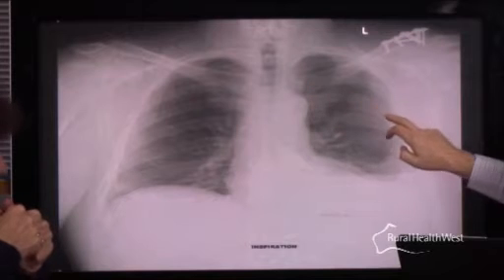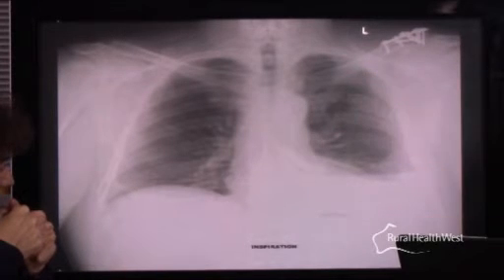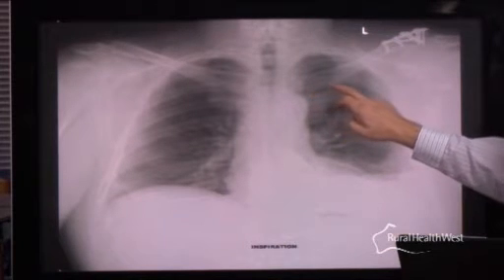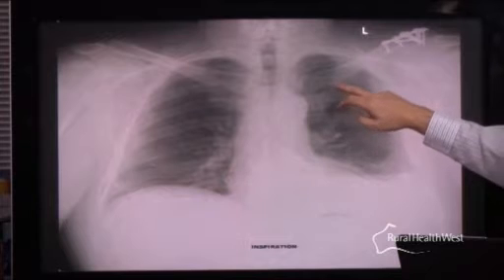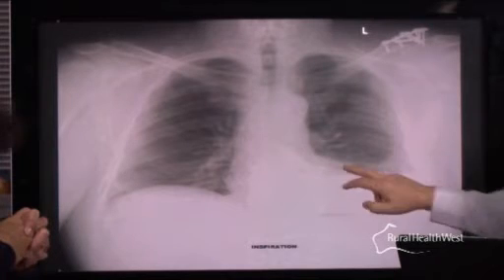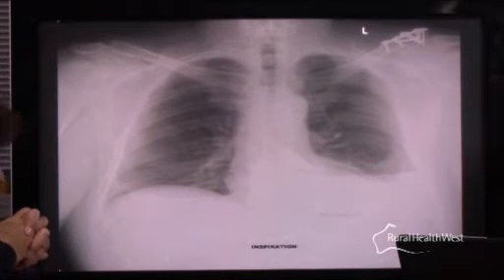You can see the pleural surface running down through there, and so there is a pneumothorax present. Okay, could you just re-point that out, because it's not enormously obvious? So that's the margin, the edge of the pleura, lung there, yeah? And obviously it should come up to the apex, and it doesn't, and it comes down to about there. And the other thing is that there's fluid there, so it could be a pleural effusion, but it's probably a hemothorax, given that there are multiple rib fractures and a pneumothorax. So there is a hemopneumothorax present, and there are areas of atelectasis and collapse toward the lung base. In this patient, the first thing to notice also is that there is no mediastinal shift, so it's not a tension pneumothorax. So that takes a little bit of the pressure off in terms of making a decision.